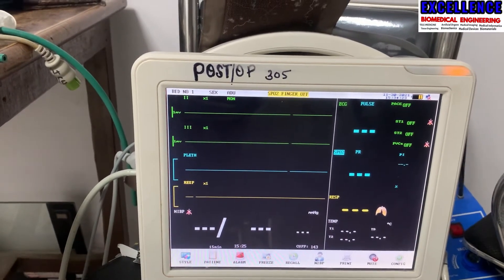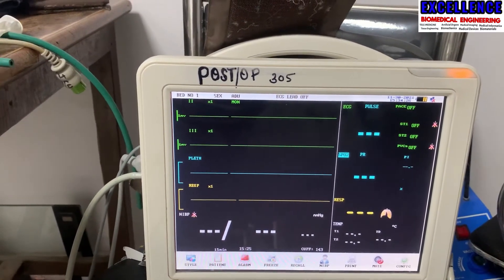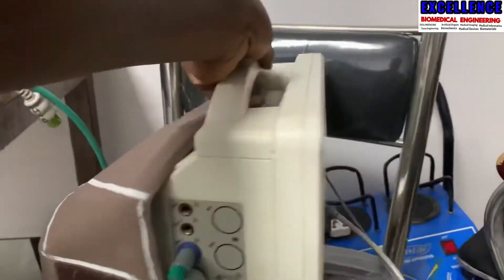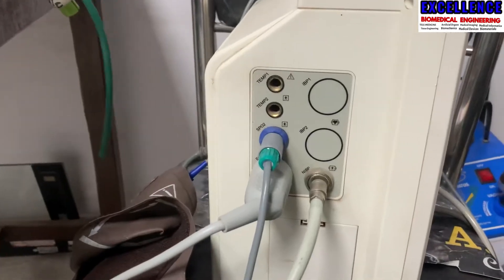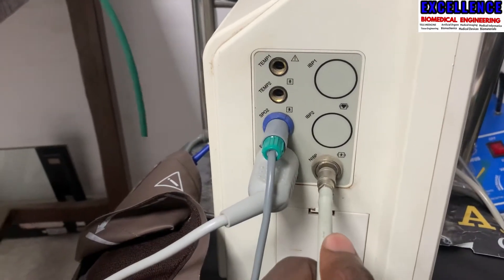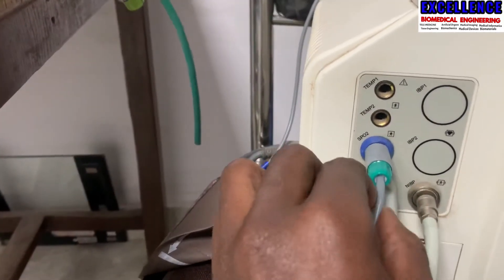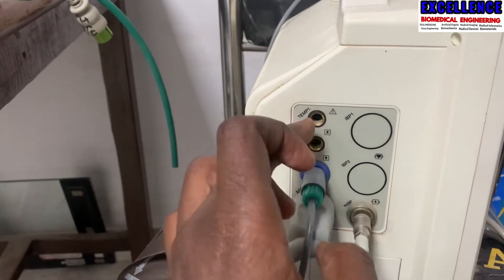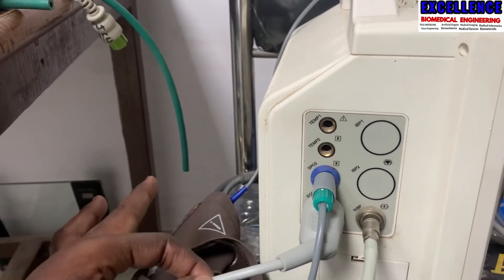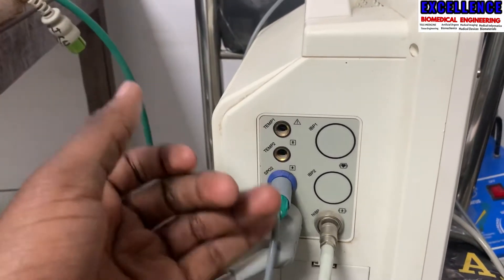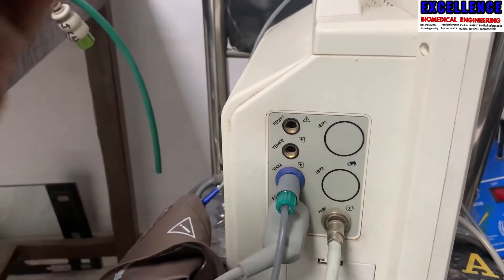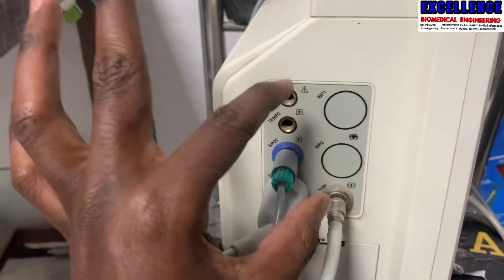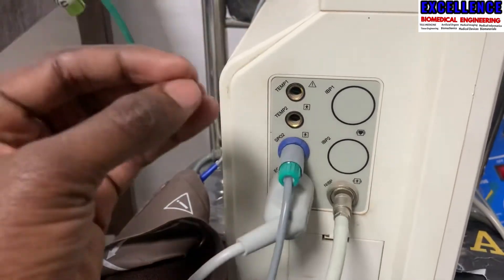If you want to know how many parameters a monitor has, you first check the inputs when it's switched off. As you can see here, this multi-parameter machine has: number one, NIBP (non-invasive blood pressure); number two, ECG probe; number three, SpO2 probe; and number four, temperature — giving us four inputs. We can also see respiratory rate derived from ECG, making it more than five parameters. This monitor is upgradable up to seven parameters, but currently it is a five-parameter patient monitor.